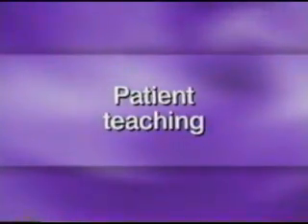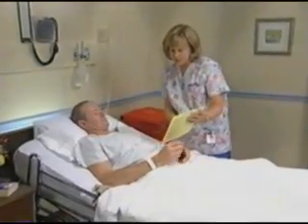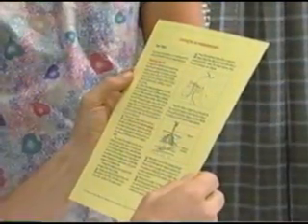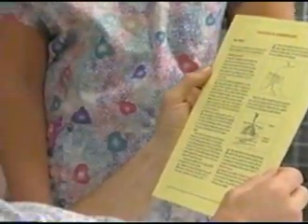The growing number of patients receiving central IV therapy makes your role in this therapy more vital than ever. By teaching the patient and his family about catheter insertion and maintenance, you can help prevent complications and keep the catheter in good condition. In your teaching, review the purpose of the therapy, the process of dressing and equipment changes, and evidence of possible complications.